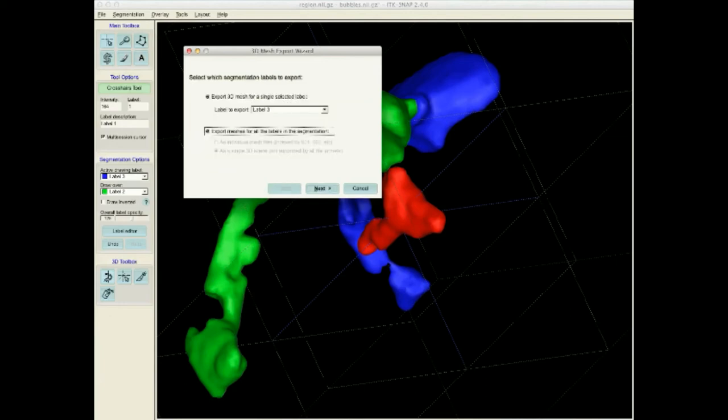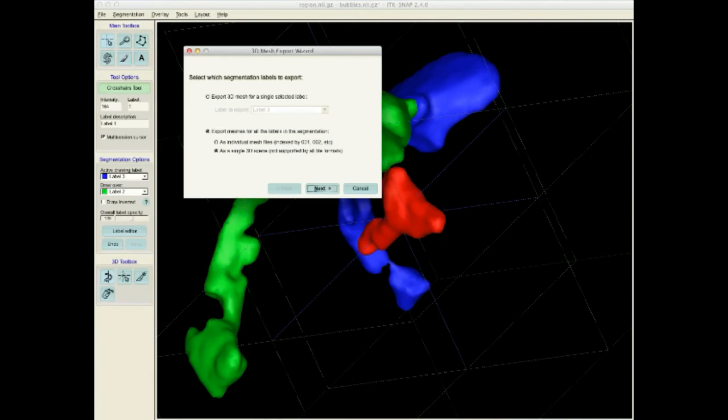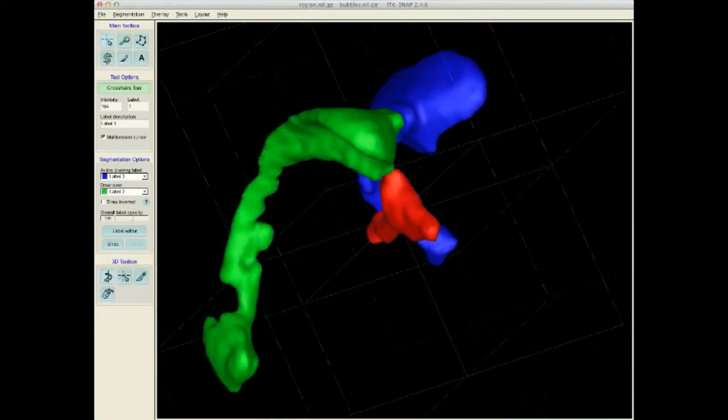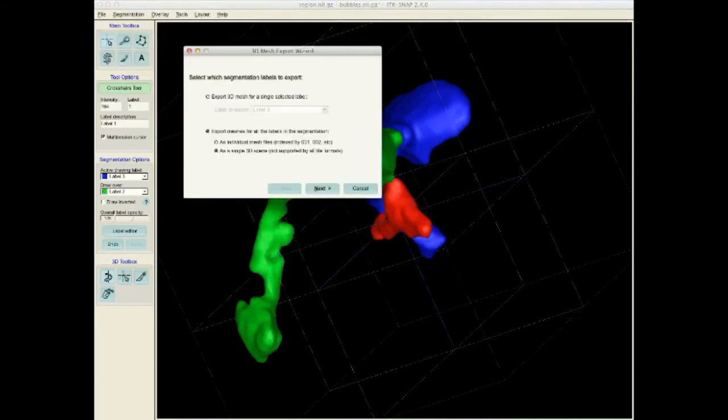Oh, you talk about STL. If you do a scene, then only VTK really works. STL, I don't think, supports a scene. You can open the VTK file in software like Paraview directly. Without Paraview, we cannot convert. Well, I mean, you can convert, but Paraview lets you open it and view. For MeshLab, I think you might need another converter.